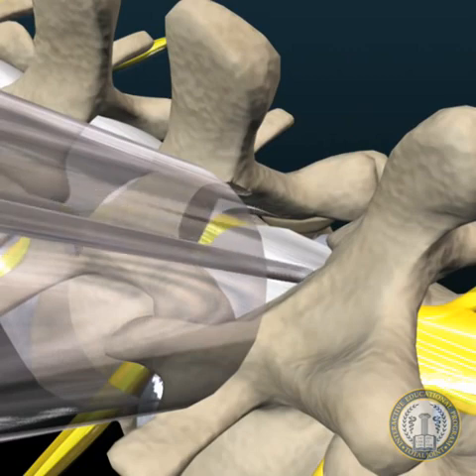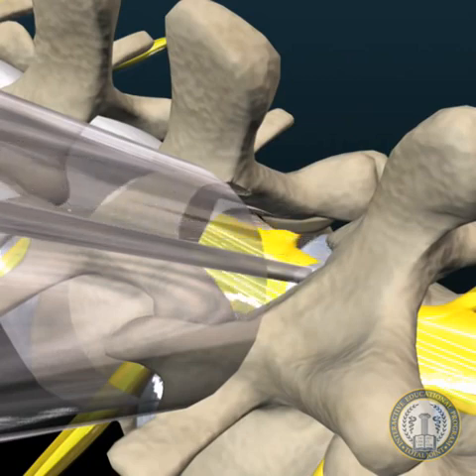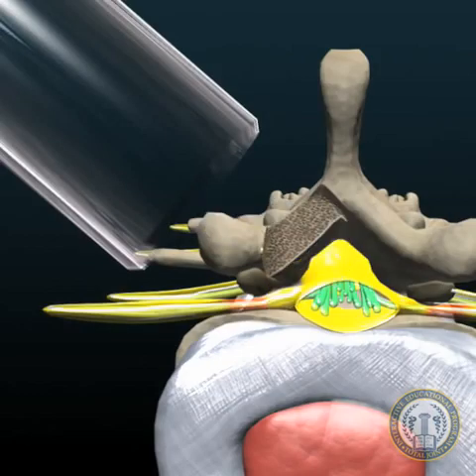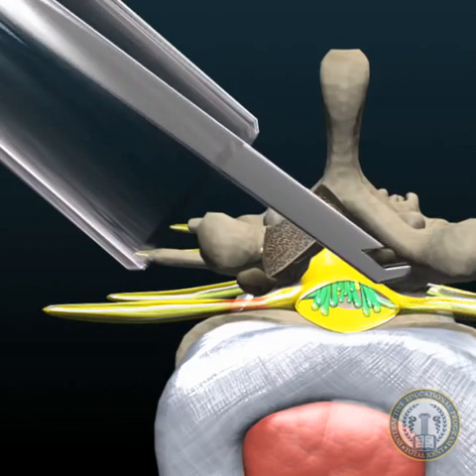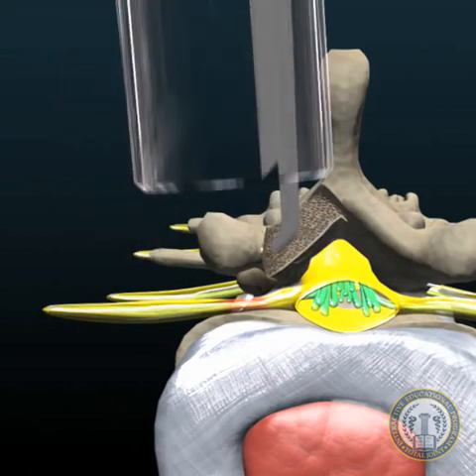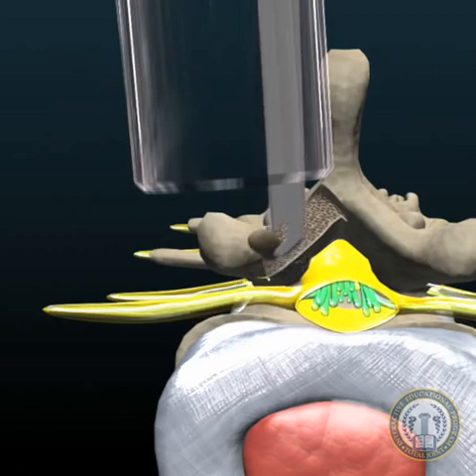After accessing the contralateral lateral recess in this manner, the ligament is then dissected away from the bone edges and dura and resected bilaterally. The contralateral lateral recess is decompressed with Kerrison rongeurs as described for the open technique. The tube is then angled back to the ipsilateral side for final ligament removal and lateral recess decompression.